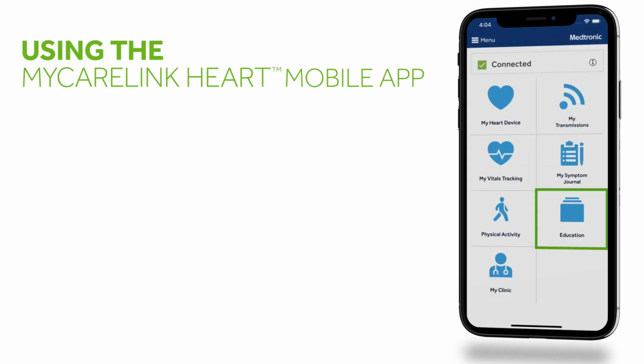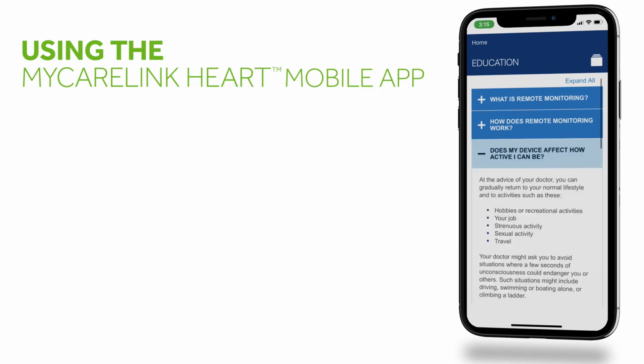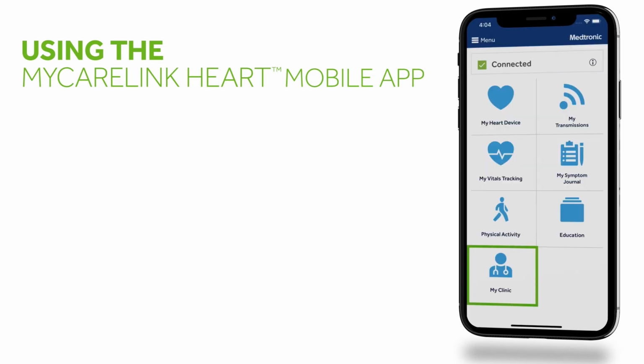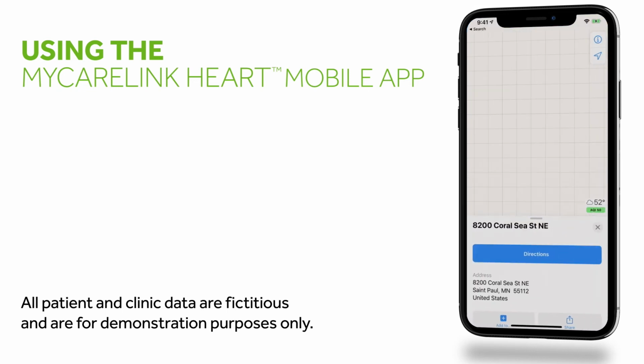The Education tile gives you easy access to frequently asked questions and answers about living with a heart device. The My Clinic tile lets you view information like the location and phone number of your clinic. You can also access directions to your clinic in this tile.